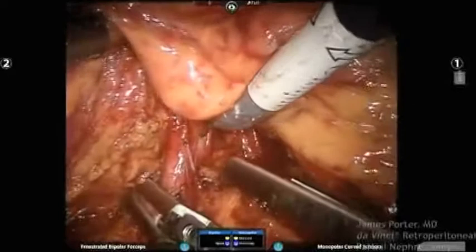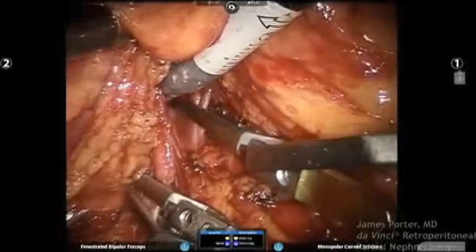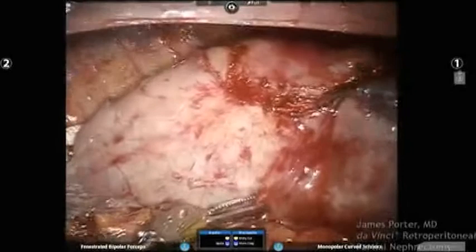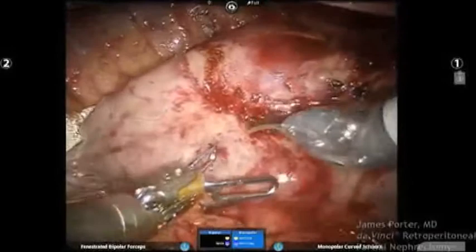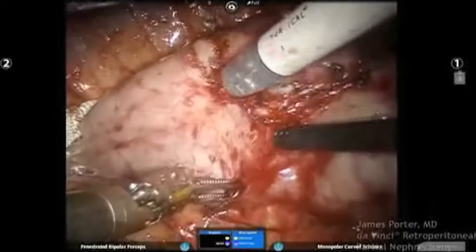I think you're either committed at this point or you're not. I don't know a frozen section here that would change what I did at this moment. I tend to agree with you, Eric. If it wasn't AML, I wouldn't stop. I would still treat her at this point. The preoperative CT scan really didn't look like it had negative Hounsfield units, and I would proceed at this point.